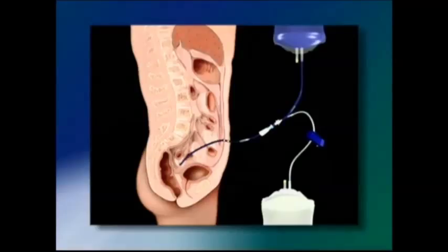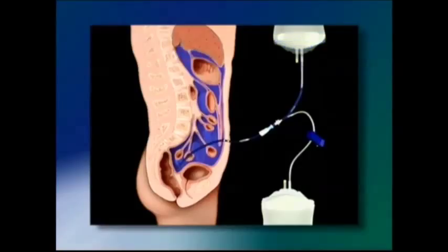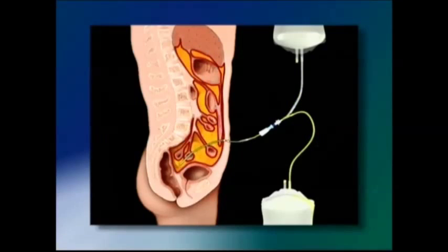Peritoneal dialysis, or PD, is a type of treatment for kidney failure that removes excess waste and water from the blood across the peritoneal membrane in the abdominal cavity. PD uses the peritoneum as a natural semi-permeable membrane. The excess waste and water cross the peritoneal membrane into a special dialysis solution and then leave the body through a tube called a catheter.